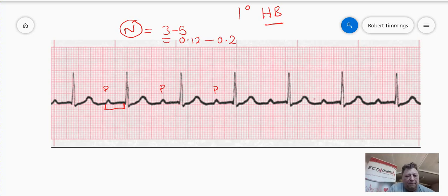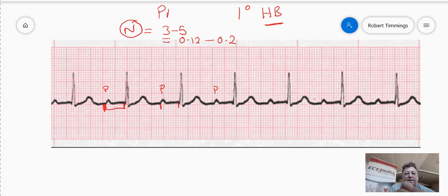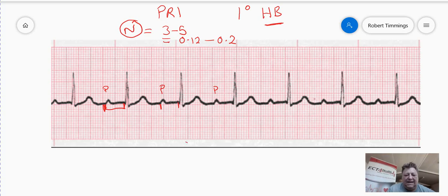That's considered a normal PR interval — from the beginning of the P wave to the beginning of the QRS complex. You can clearly see from this first degree heart block that the PR interval is much, much longer. If we count those boxes, we're getting almost 8 boxes. With 8 little boxes of delay between the P wave and the QRS complex, what we've actually got here is a heart block, and that's our diagnosis.